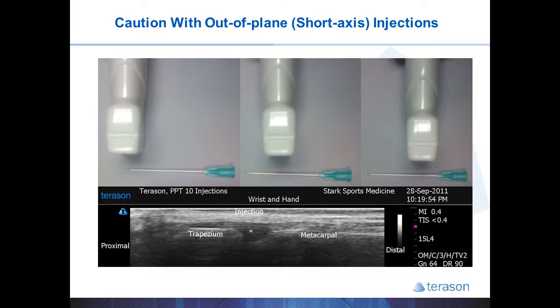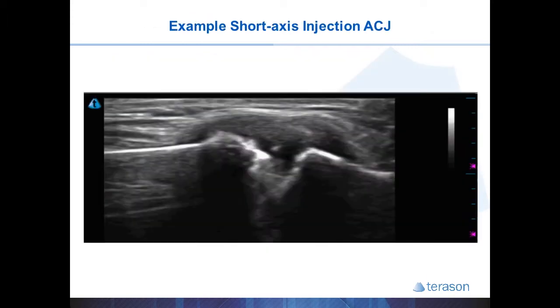There are several things you can do to help prevent accidental injections with short axis procedures. In this example of a short axis injection of an AC joint, once you see the white dot appear in the joint, it's very important to stop advancing the needle — you could continue to advance it and your ultrasound image would not change. What I typically do is advance until I see the needle tip appear, stop advancing, actually pull back a little, the white dot should disappear, then advance it again and the white dot should reappear. That reassures me that I'm looking at the needle tip, and then I can inject the joint.